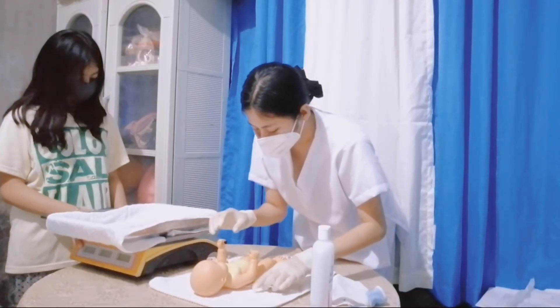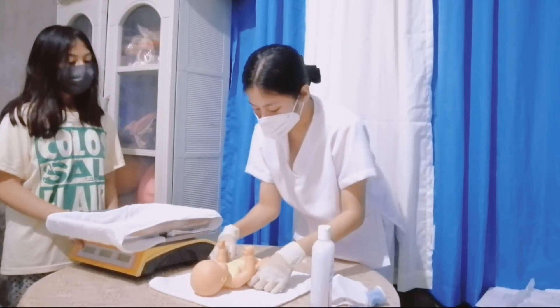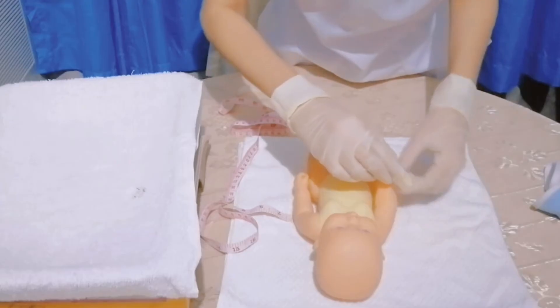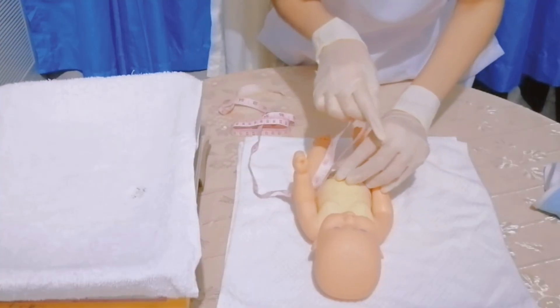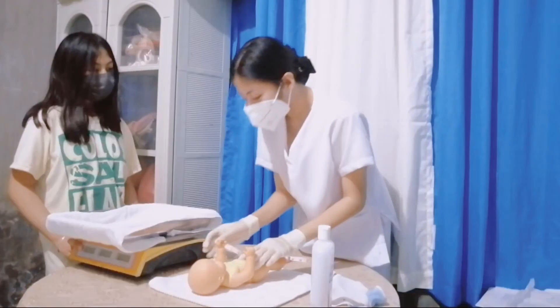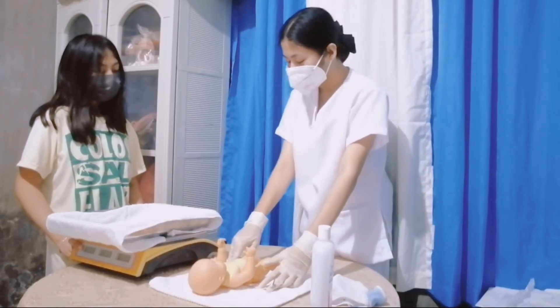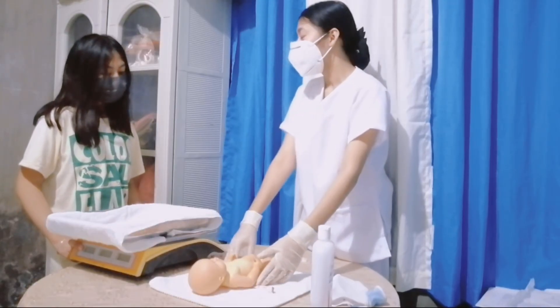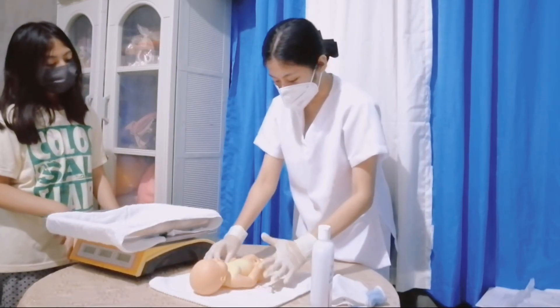Now I will measure the abdominal circumference of the baby. The baby's abdominal circumference is 31 cm. The normal value for an abdominal circumference of a baby is within 30 to 33 cm. Therefore, your baby has a normal abdominal circumference.